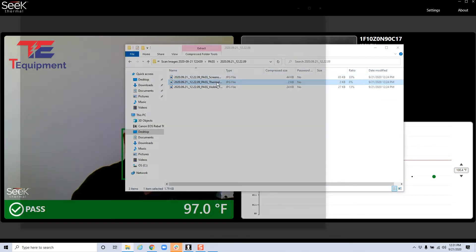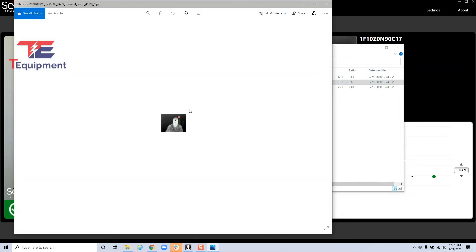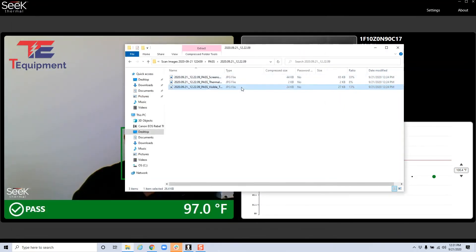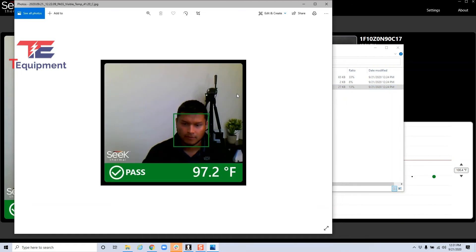One is the whole screenshot of the whole application. The second is the thermal view, so this is a smaller thumbnail. And this is the visible light camera, which is the one you're most likely to use. So it has the temperature, the person, everything's all in one here.